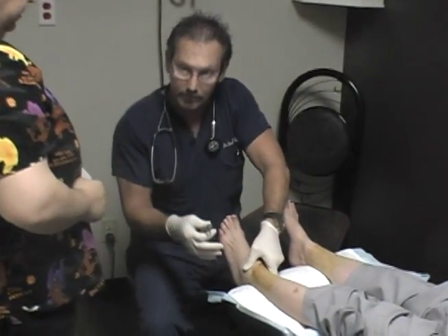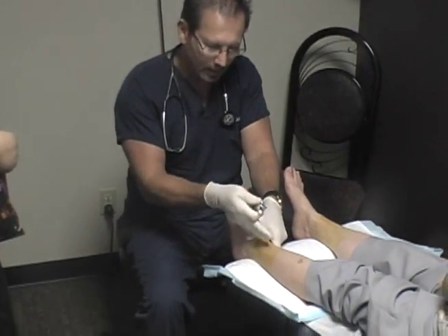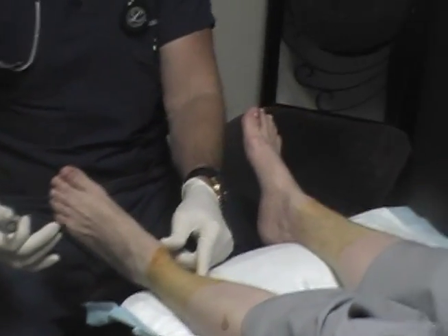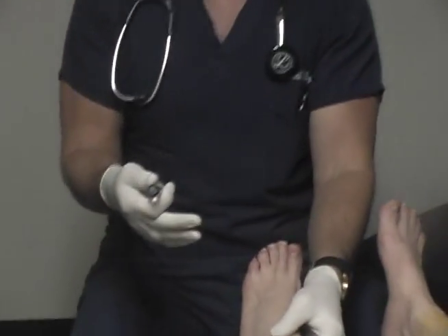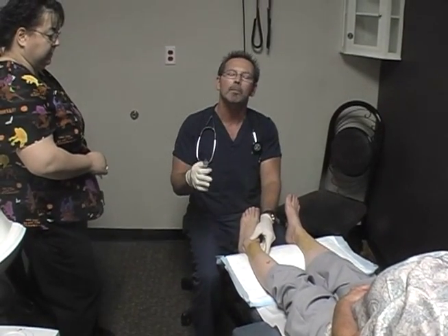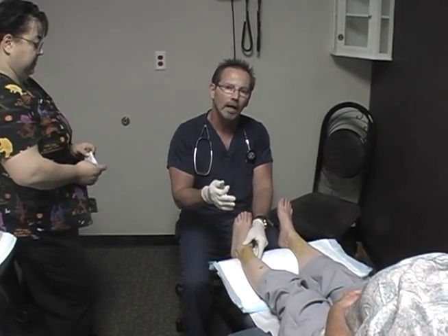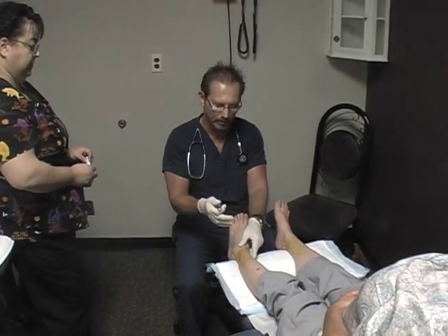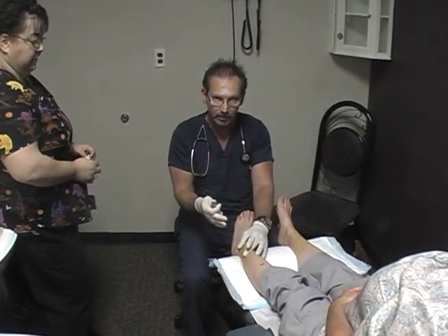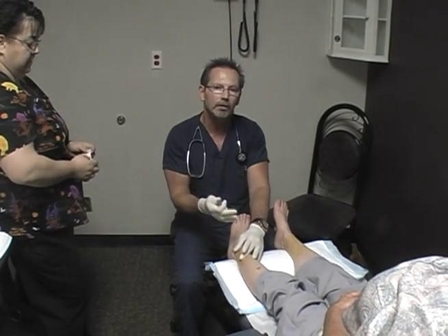I have five main points that we inject and they correlate with the peripheral nerves: sural nerve, deep peroneal, superficial peroneal, posterior tib, and saphenous nerves. We will not be injecting the nerves themselves — we will be infiltrating right next to the nerves. Later we will use a device to help push the medication into the nerve and cells of the nerves and muscle. This will help increase blood supply, help open the sodium gates, and allow the toxins that have built up over time in the nerves to exit.